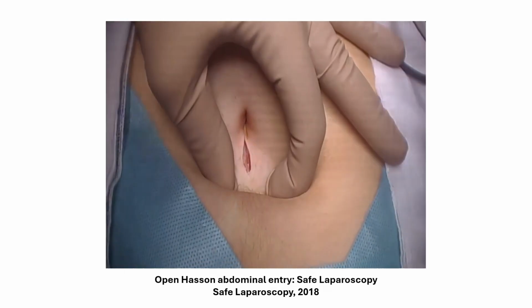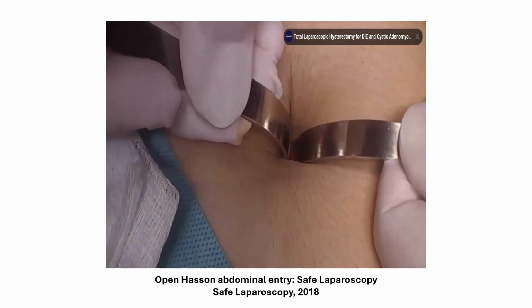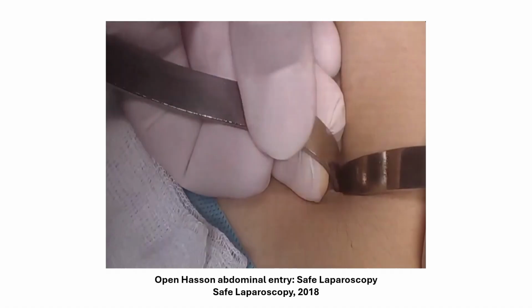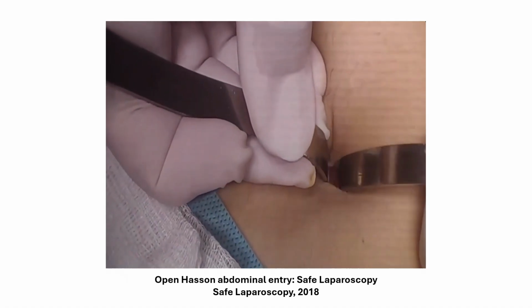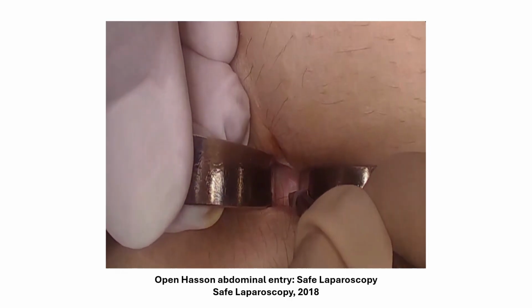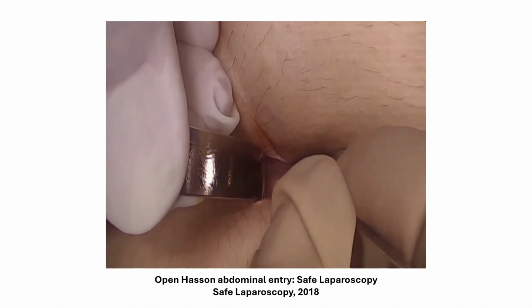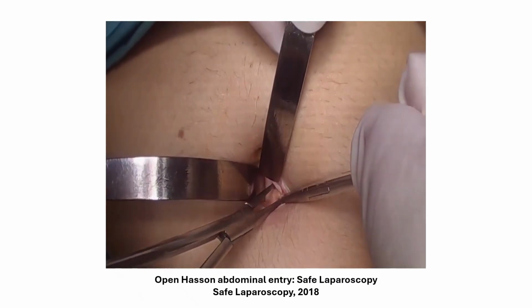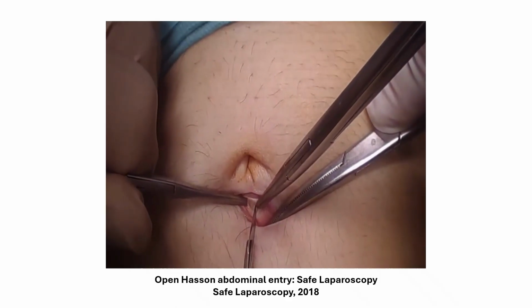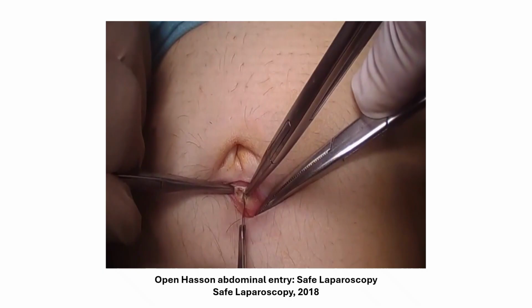The surgeon makes that initial incision inferior to the umbilicus, and then with some S retractors, we're going to go ahead and pull back through blunt dissection some of those superficial layers. With the blade, we're going to go ahead and cut the next set of layers. Again, the surgeon is able to visualize everything that he or she is able to cut. The surgeon's going to then go ahead and clamp onto those deeper layers and then pull those back. And then return with the blade, cut through those deeper layers.